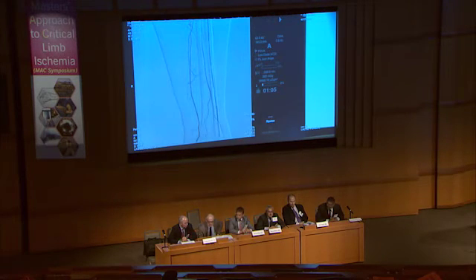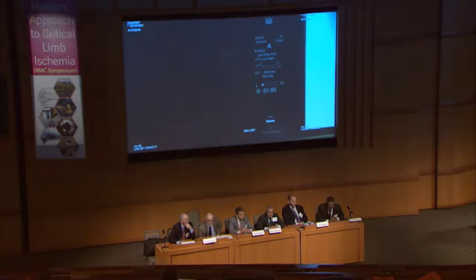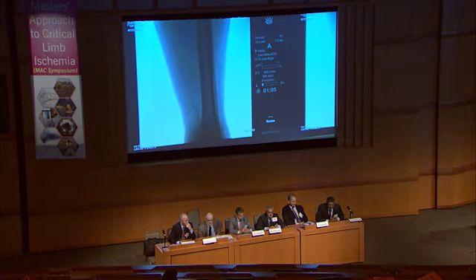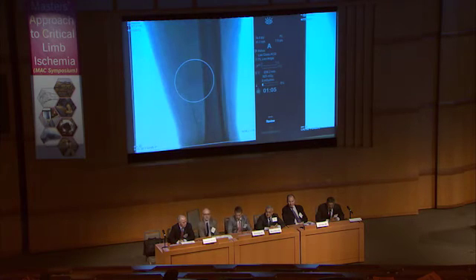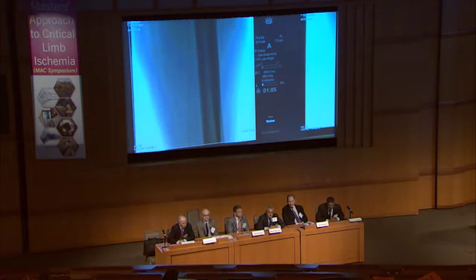So maybe the remaining stenosis is just at the proximal edge of the screen, so it's a very short remaining stenosis. If you recap your previous images, you can see it, so it's only a 2 centimeter long residual stenosis which needs additional treatment. Go back 2 or 3 runs, then you will see it. Yeah, I agree with you. I'm going to do that part. It's right there, right beyond where the balloon was. So we just need to get 2 more centimeters.